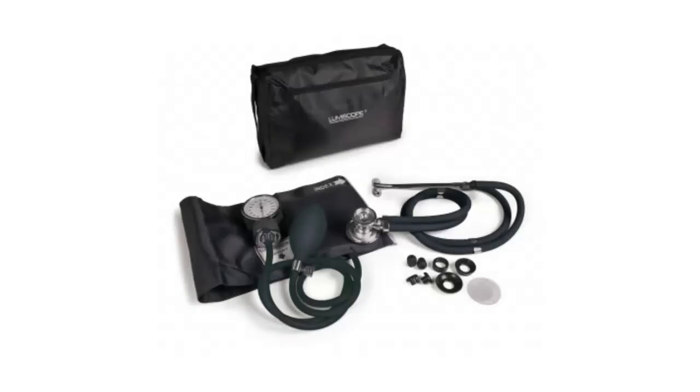The aneroid sphygmomanometer blood pressure and Sprague combo kit in black is a versatile and essential tool for healthcare professionals. This kit includes an aneroid sphygmomanometer with a matching nylon color cuff and a Sprague Rapaport style stethoscope.